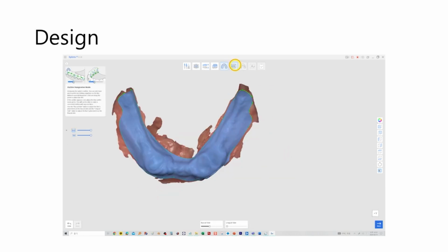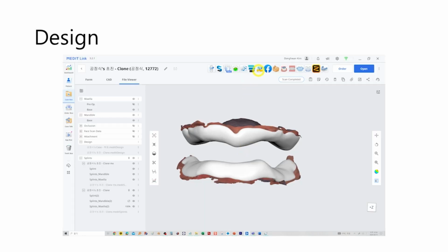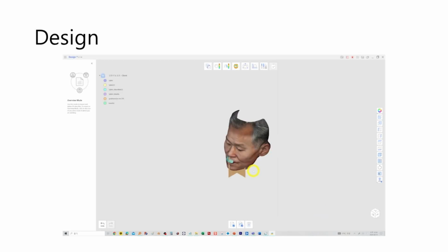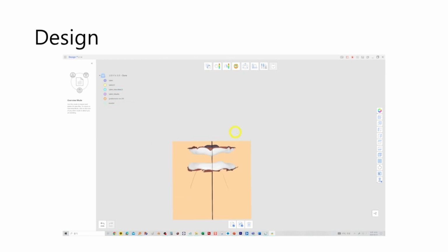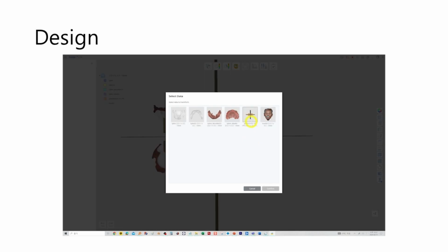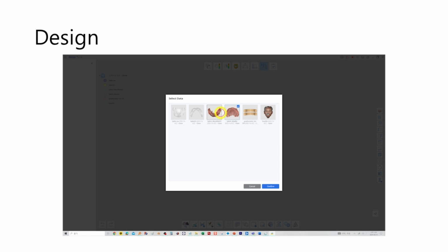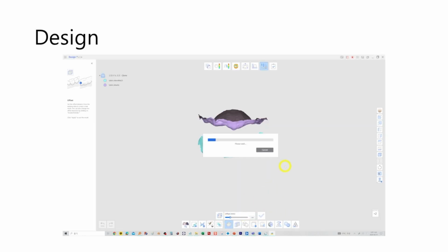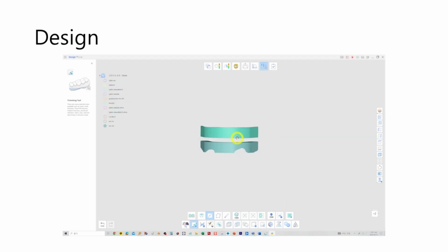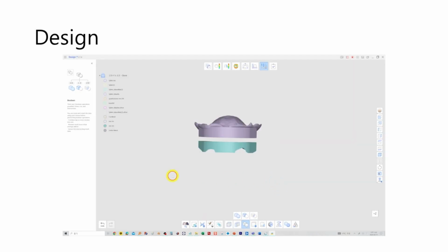The same process is repeated for the mandibular model. Afterward, we run Medit design again to combine the splint with the jaw scans, adjust the rim mesh by referencing facial scan data, and remove any extraneous flat areas. By adding a 1 mm offset to both jaws and subtracting from the rim offset, we complete the integration of the rim and splint. The final step merges the splint and rim to complete the tray design.